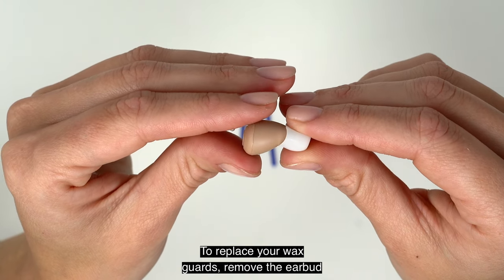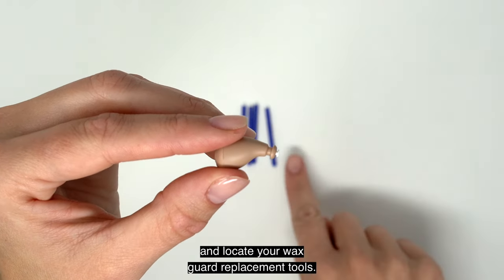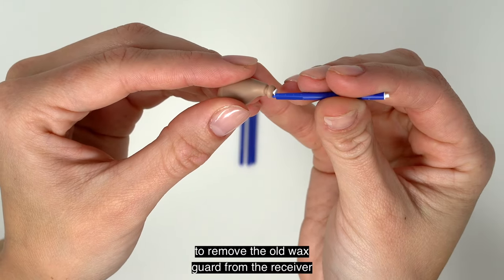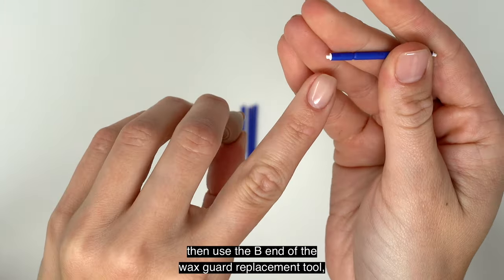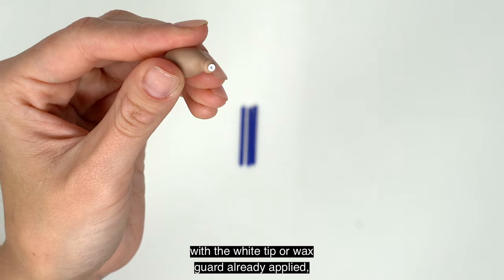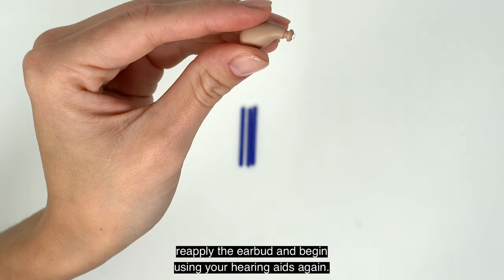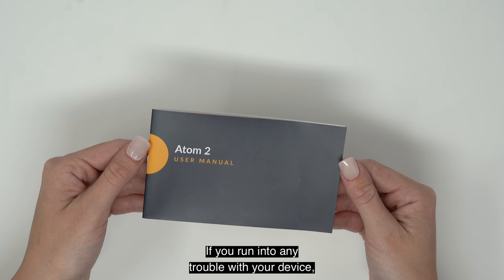Your Atom 2 hearing aids come with a set of wax guard replacements. To replace your wax guards, remove the earbud attached to the receiver and locate your wax guard replacement tools. Use the A end of the tool — which does not have the white tip — to remove the old wax guard from the receiver. Once removed, flip the tool over 180 degrees, then use the B end — with the white tip or wax guard already applied — to install a new wax guard. Once the wax guard is back on, clean off the rest of the device, reapply the earbud, and begin using your hearing aids again.